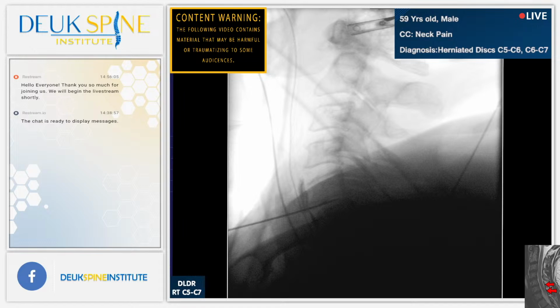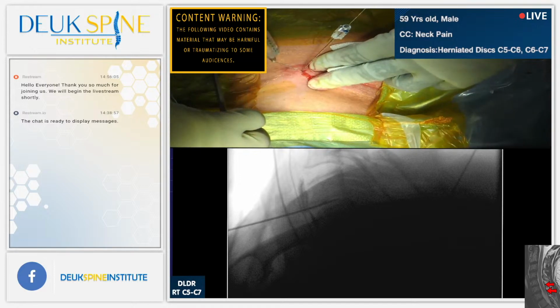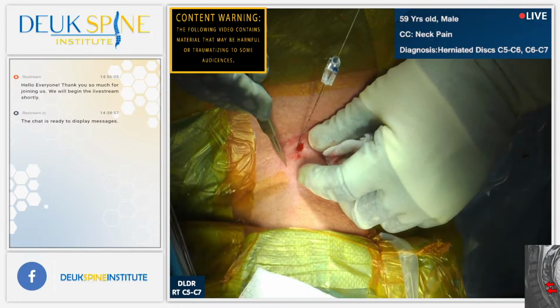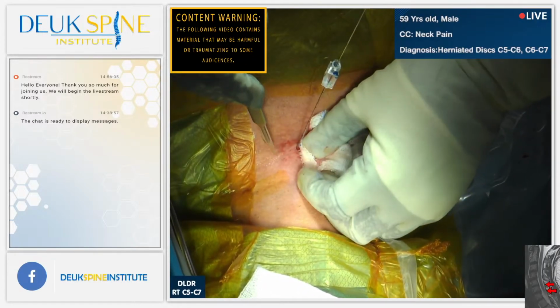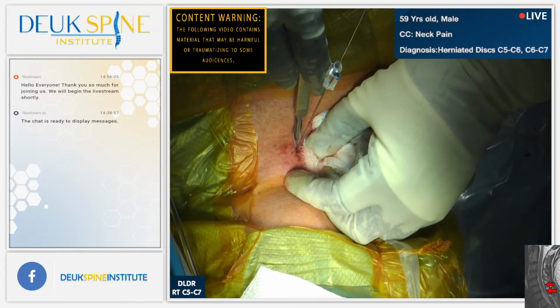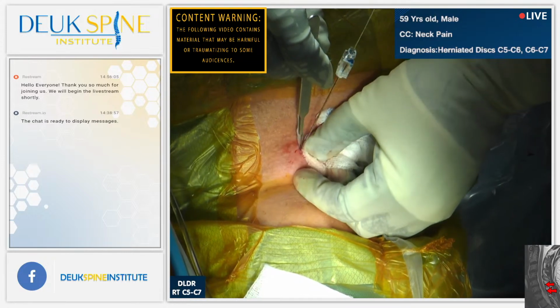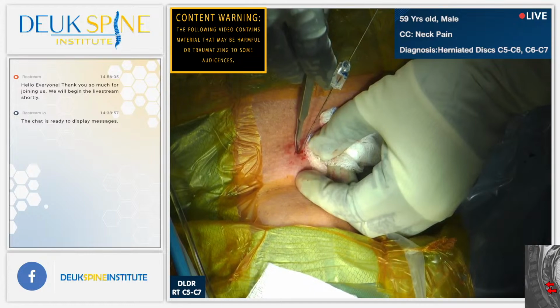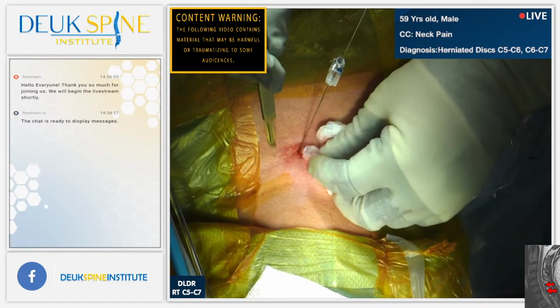So we're going to make our skin injection and then skin incision. So we can definitely get C5-6. And I'm hoping and expecting to get C6-7. Our last patient that did the fusion, he's doing well. No problems. He's just having pain. He's going to be ready to go home in about 30 minutes. The incision for this surgery is about 4 millimeters.